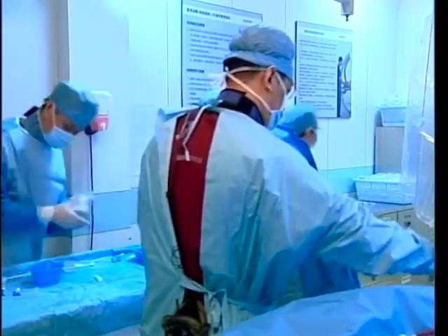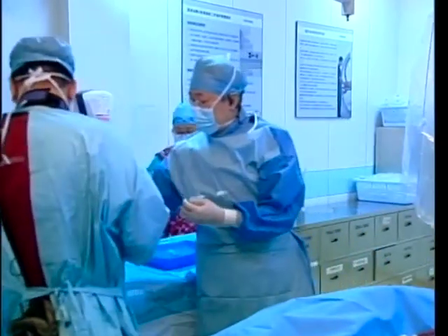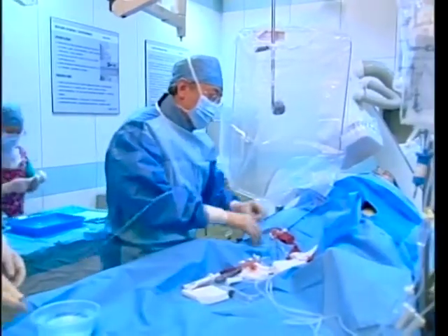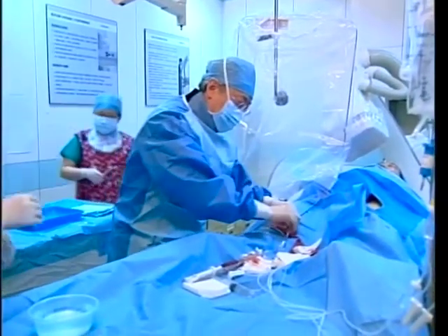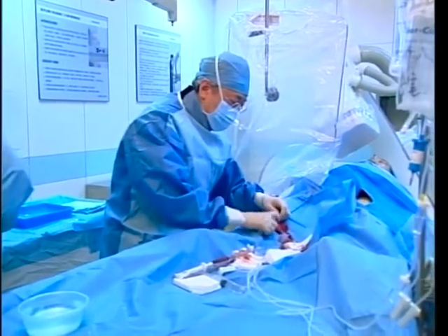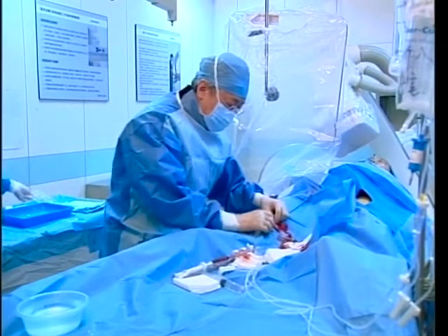So let's move. What is also nice with this device that it requires only a 10 French sheath, which sounds trivial, but the big sheath with the other devices are sometimes a hassle to get them into the groin and also transeptally.